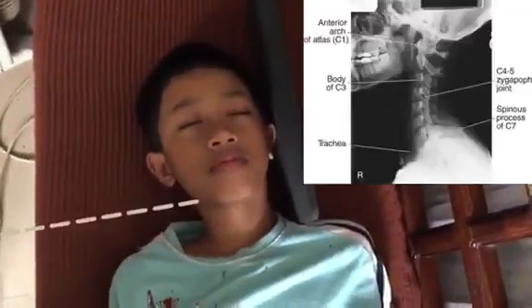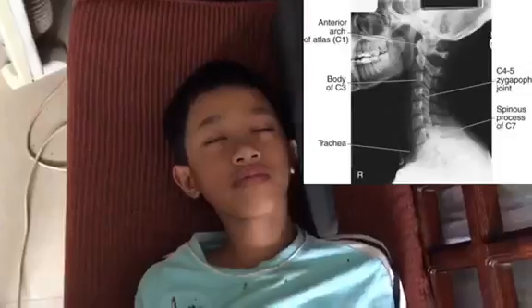The central ray is perpendicular, 1 inch distal to the mastoid tip. This position prevents the superimposition of the laminae and atlas.